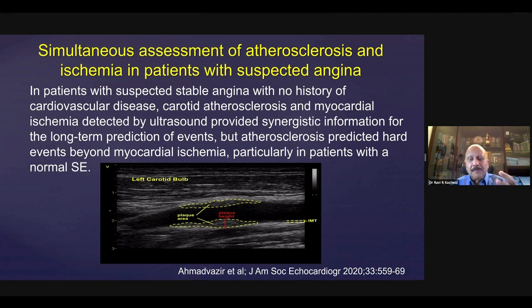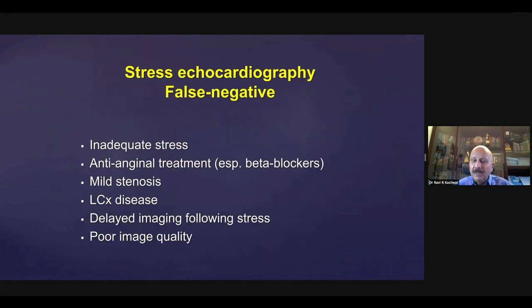So it does give you good information that with coronary artery disease, we don't have to wait for an acute coronary syndrome or for coronary artery disease to develop, but sometimes we can be the guardians so that they do not develop disease further. Even though carotid intima-media thickness is still not in any of the leading guidelines, it does open up an avenue in which it can be used. So this is from the United Kingdom, and I just mentioned this because it can be helpful in prognostication.